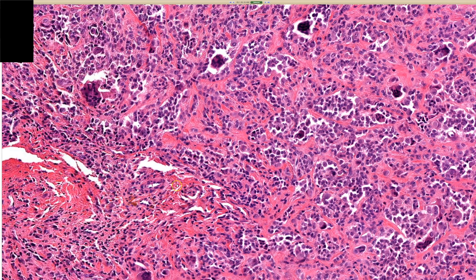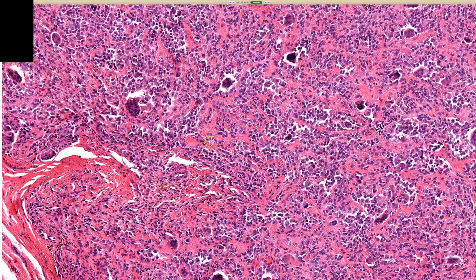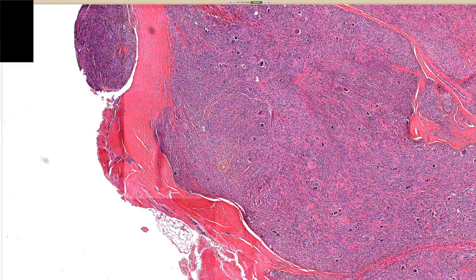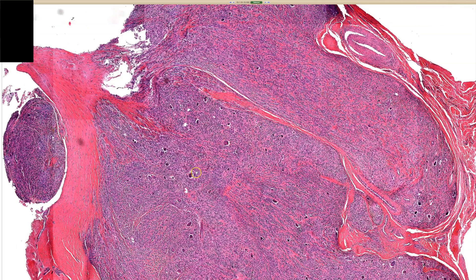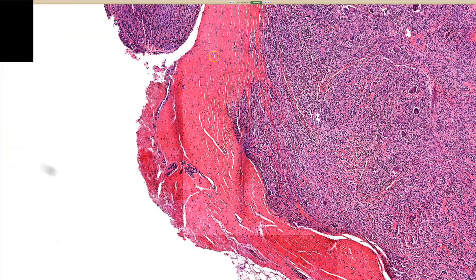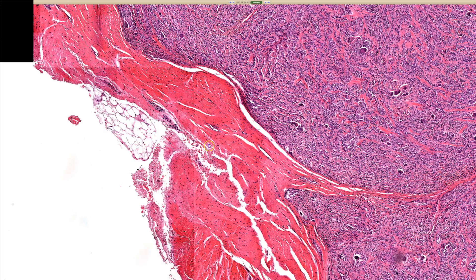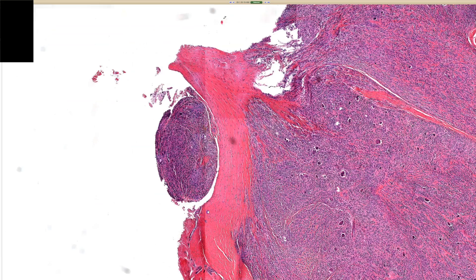This is a giant cell tumor of the tendon sheath, also known as tenosynovial giant cell tumor, localized type. There is a diffuse type, but it's more in big joints and deep soft tissue — not really a dermpath entity. In dermpath you rarely ever see this unless you do soft tissue work, because usually these are deep nodules attached to dense regular connective tissue: tendon, tendon sheath, fascia. This is part of the tenosynovium, which is where these usually arise, from a tenosynovial-lined tendon on the hands, fingers, feet, or toes.